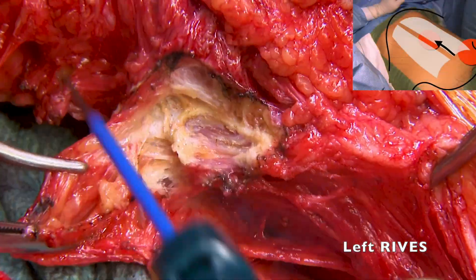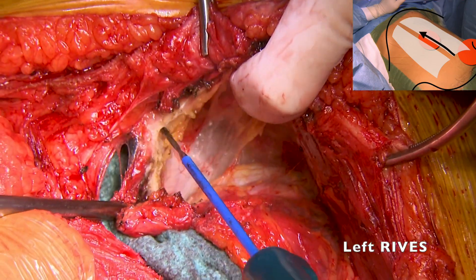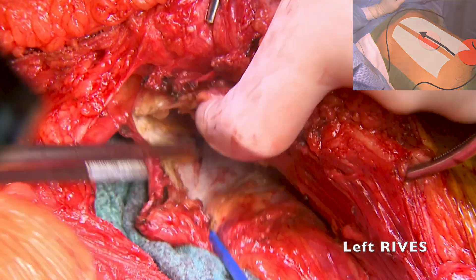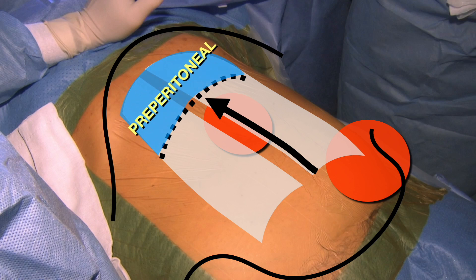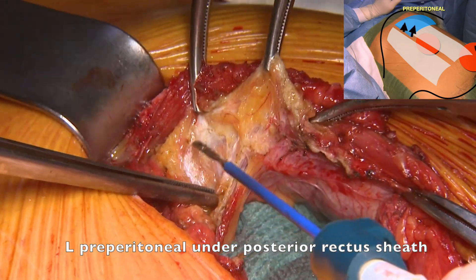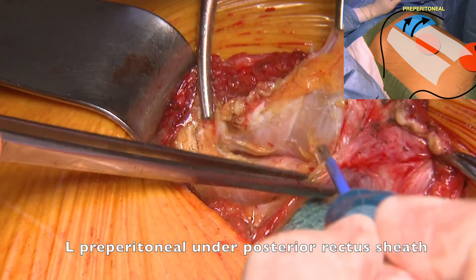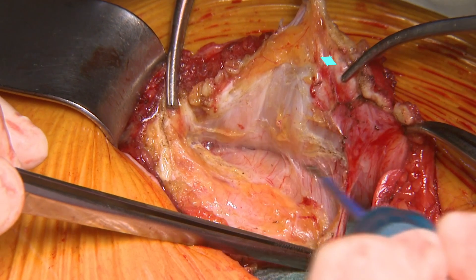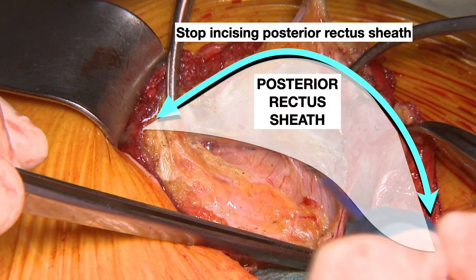The left retromuscular dissection was carried out under the rectus muscle to reach the linea alba, finding some adhesions due to previous surgery. The next step, as part of the Madrid posterior component separation, is to preserve the posterior rectus sheath in the upper third of the abdomen. We follow the protection of the midline preperitoneal fat and the fatty epigastric rhomboid to get into a layer between the peritoneum and the posterior rectus sheath, so we do not incise medially the posterior rectus sheath.